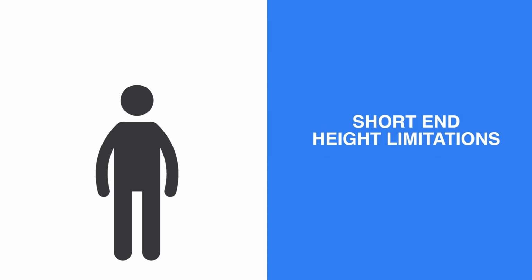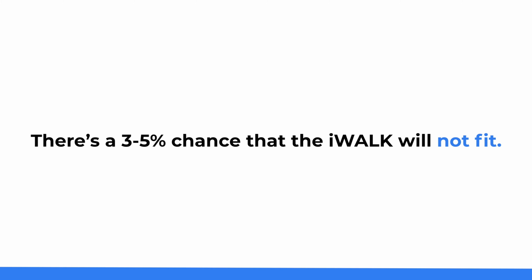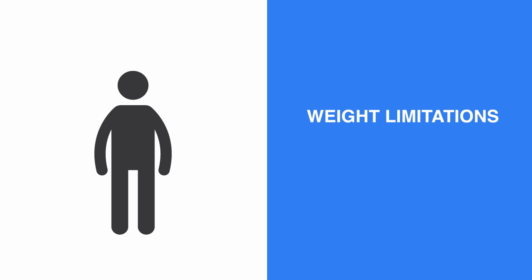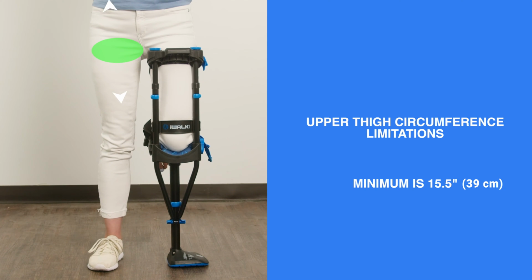If you're at either the short end of the spectrum, from 4'10" to 5'2", or at the tall end from 6'2" to 6'6", there's a 3 to 5% chance that the iWALK will not fit. Weight. The patient must be no more than 275 pounds. Upper thigh circumference at the top of the leg, minimum is 15.5 inches, maximum is 28 inches.